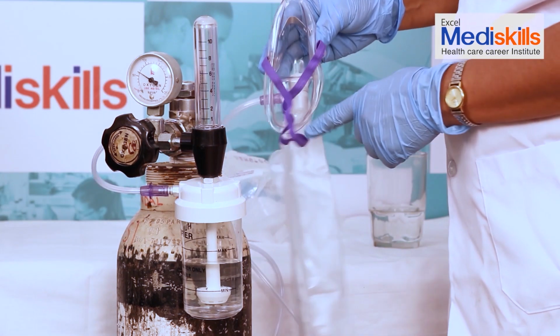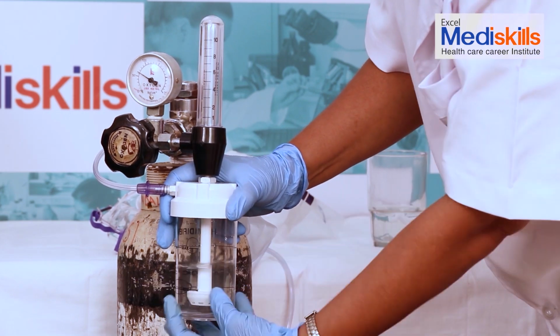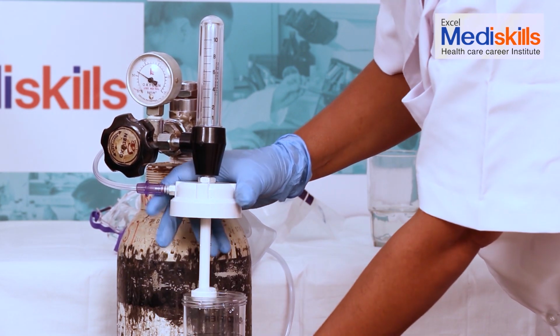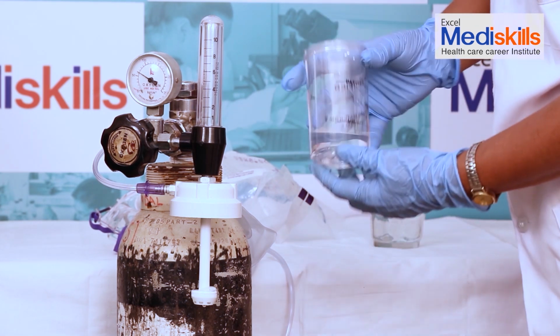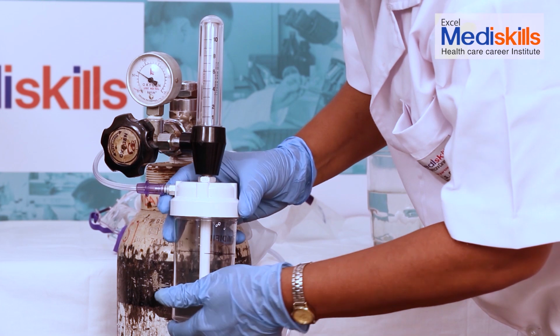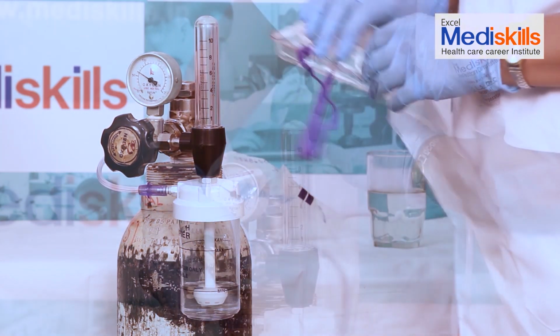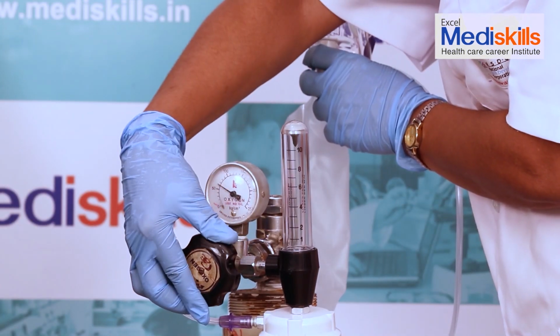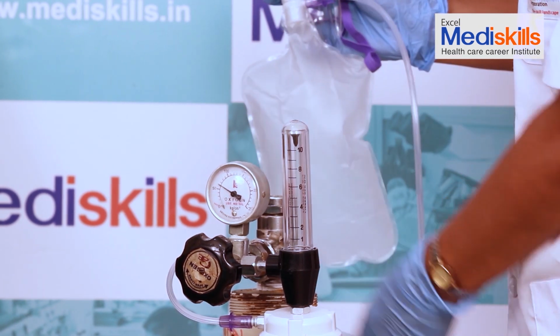Since here we will give oxygen at a greater level, the water level has to be decreased to minimum. So we have now reduced the water of the humidifier into this glass. Now we attach this humidifier to the cylinder. Now we will attach the mask to the patient's face. Now we start the oxygen cylinder, adjust the oxygen level to high and inflate this bag. Then we will lower the face mask of the patient and inflate the bag mask or reservoir mask.